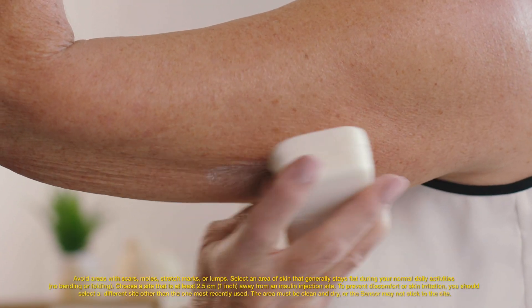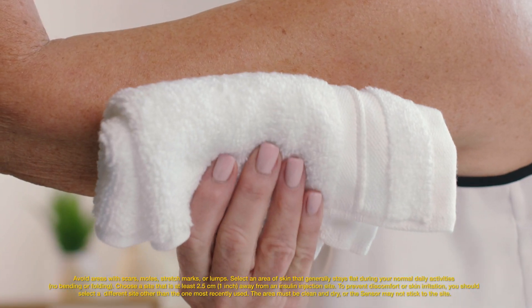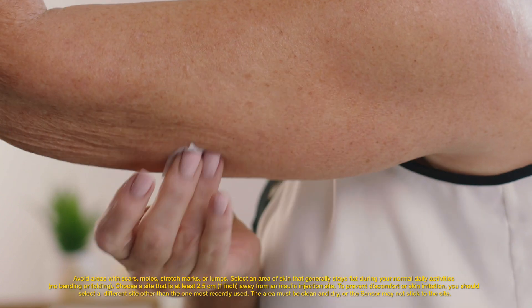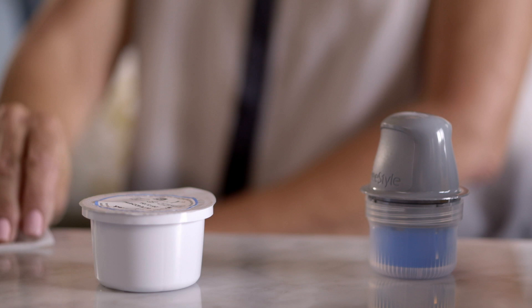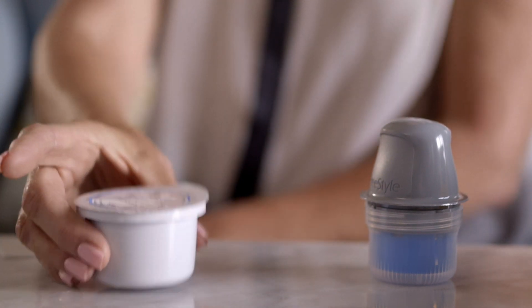It's easy to put on a new sensor. Here's how Sarah puts on the new sensor. Select the site on the back of your upper arm, where you will clean it and let it dry. The FreeStyle Libre 2 sensor kit comes in two parts: the sensor applicator and the sensor pack. It also contains a product insert.